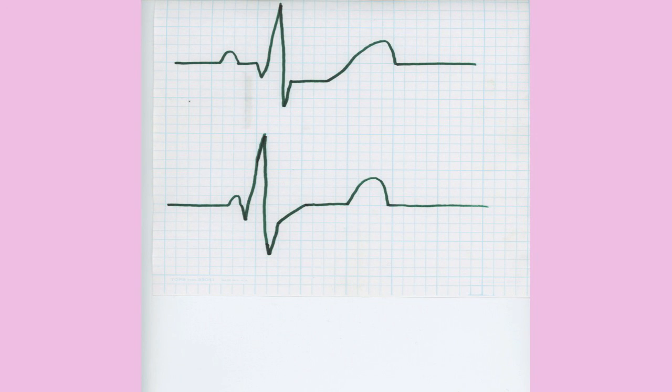And so in this case, if you're measuring the distance, the amount of ST segment depression, you don't have any. You have the exact bottom line is at the top line. So there's 0 millimeters of ST segment depression. It's upsloping, and therefore clearly this would be a negative test. No ST segment depression, upsloping, and therefore negative for ischemia on that example.